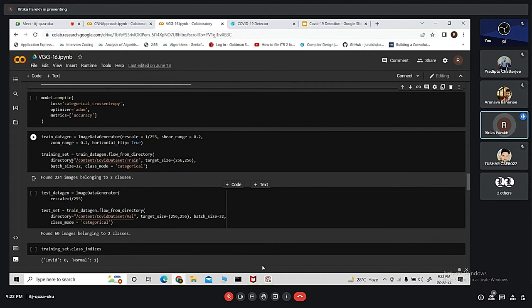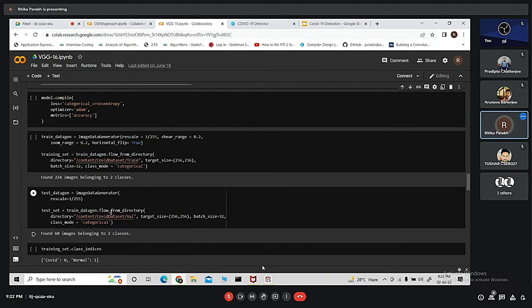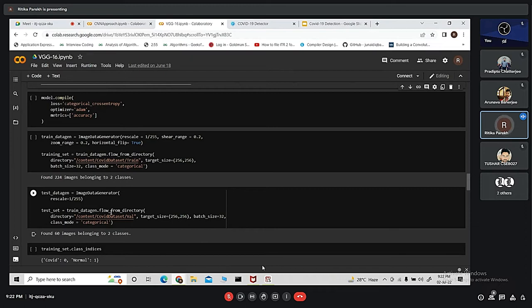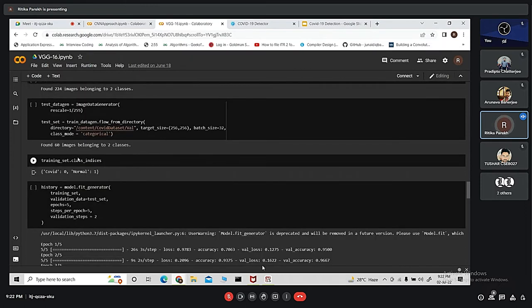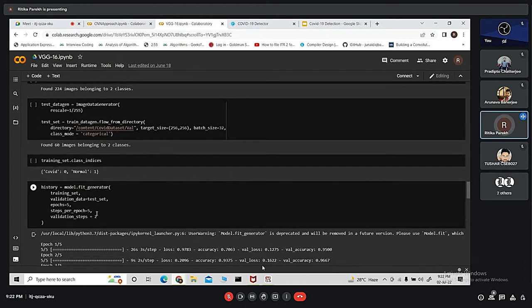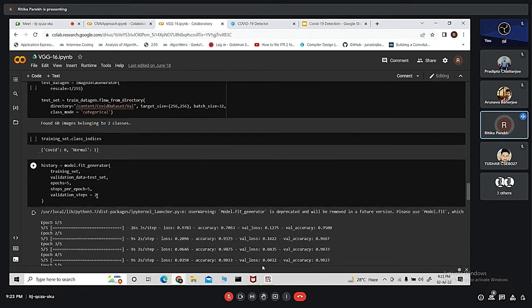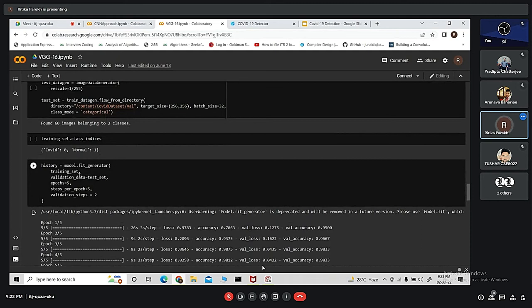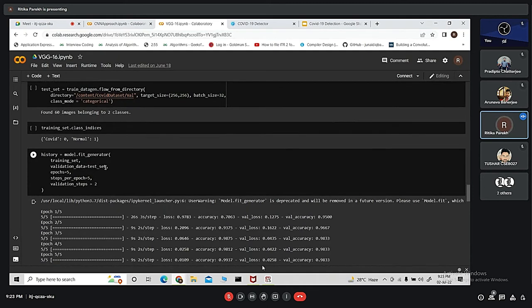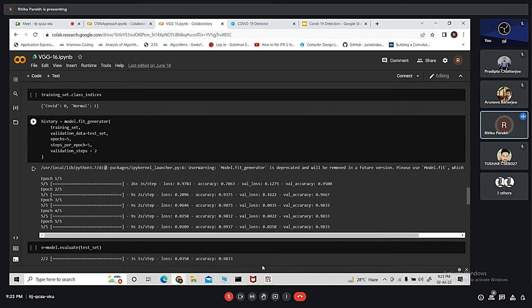Now we are dividing the dataset into training set and testing set. Using flow from directory function, we are loading the dataset and assigning it to the training_set variable and test_set variable. Next, we are checking the class for COVID is 0 and for normal it's 1. We are using model.fit_generator function and epochs, the number of iterations we are specifying as 5. Validation data is the test data, training data is training set and steps per epoch we have kept as 5.